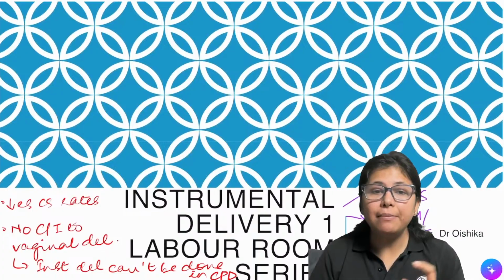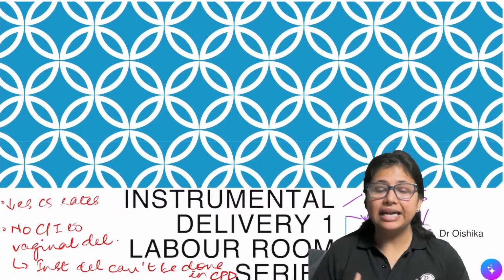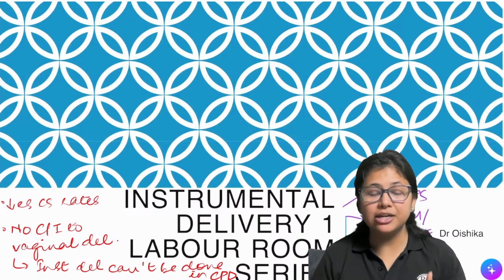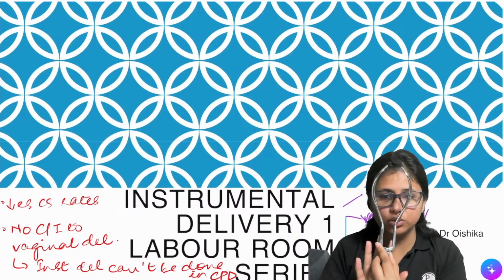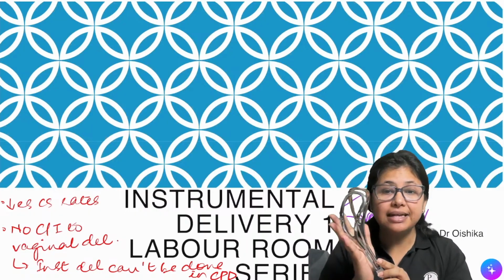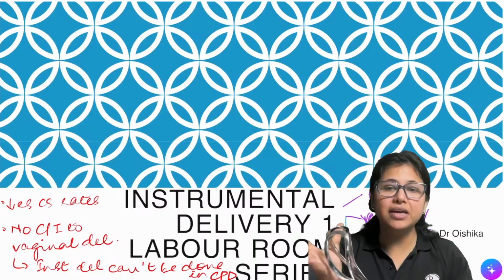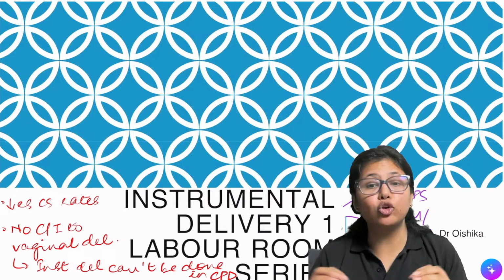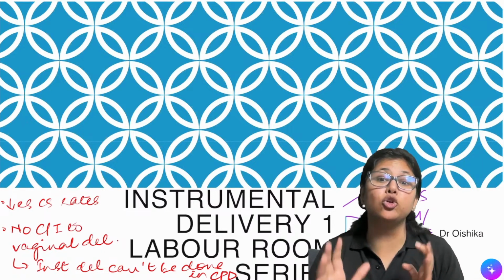All right. तो अब हम instrument जो लगाते हैं, when we apply an instrument, remember, and I will tell you what exactly we are doing in an instrument. There is a lot of pulling, there is a lot of tugging in the instrument, and there are huge instruments that are going in. For example, this is what a pair of forceps looks like. This is something that we are inserting inside the vagina of the mother, and we are grabbing the baby and we are pulling it out. Right. So remember, this is a very, very traumatic process. This is not a normal delivery.